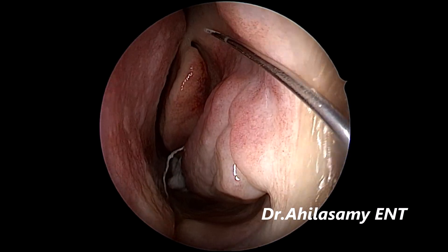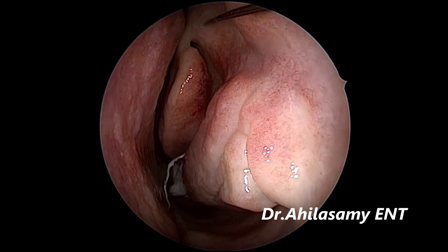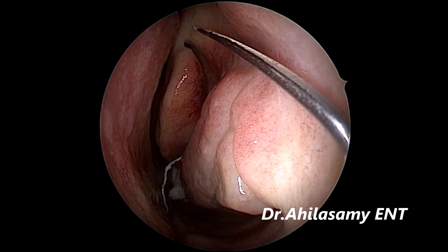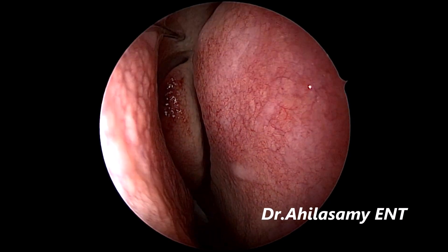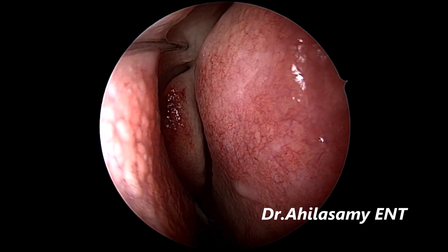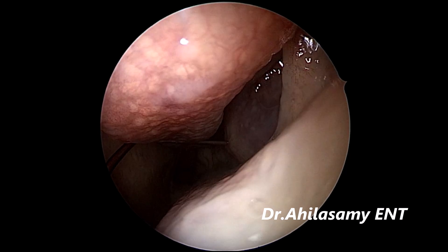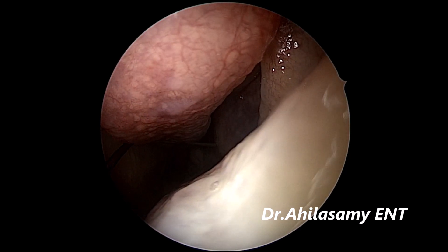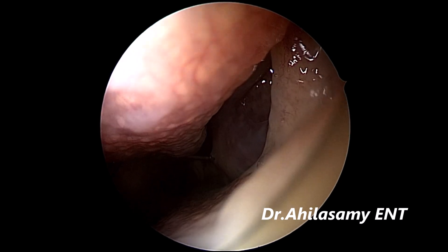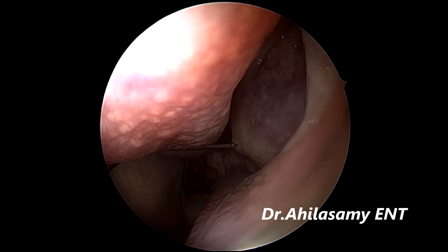So I am giving the anterior ethmoidal nerve block on the left side because I am going to do the concha correction on both sides. This is on the right side anterior ethmoidal nerve block. Then I will be doing concha crushing with Dr. Ahila's concha crusher. Before that, I am giving the sphenopalatine block on the left side.